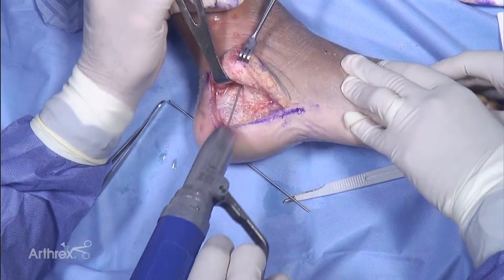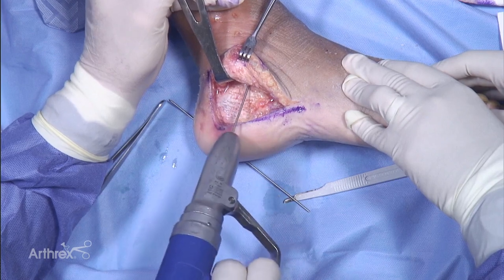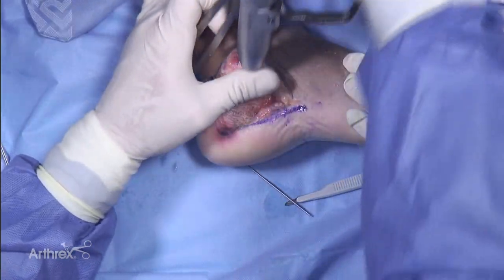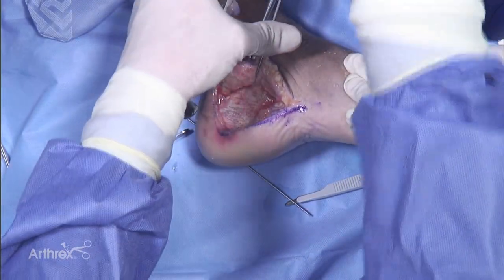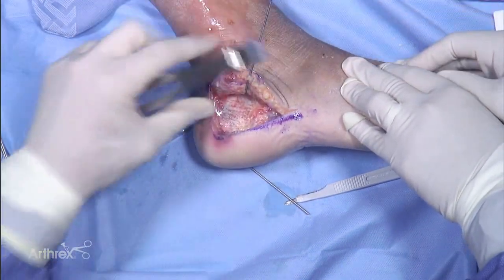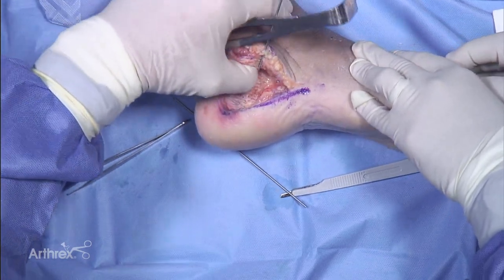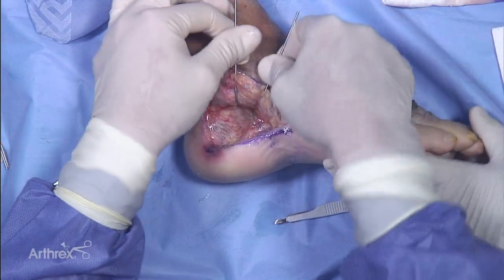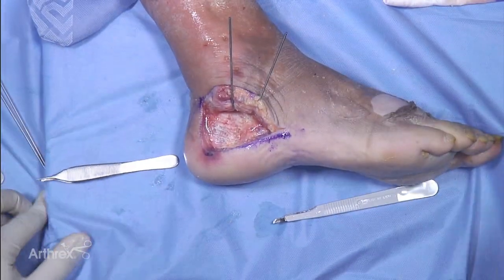You can put a couple of K-wires in as self-retractors right up into the talus. You can bend them up using the hand driver and they'll start holding your flap up. A combination of these bent K-wires and some hand retractors will allow us to see pretty well.